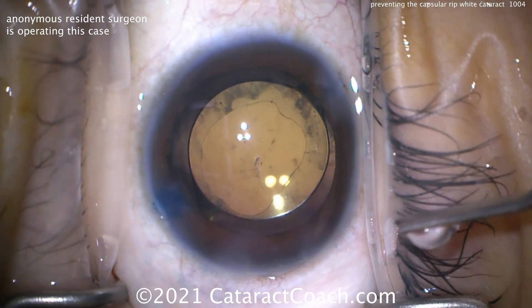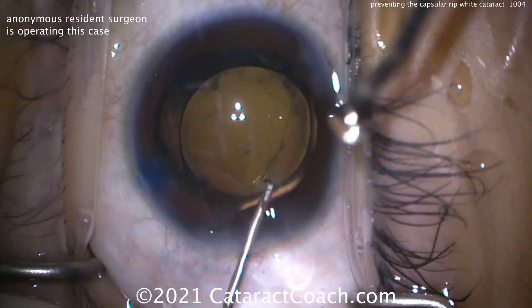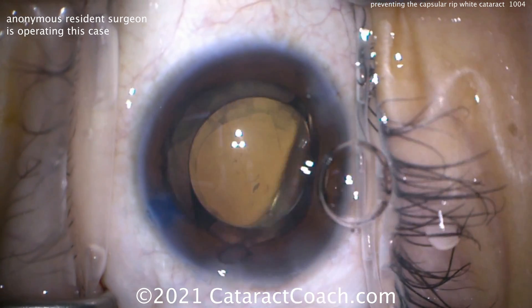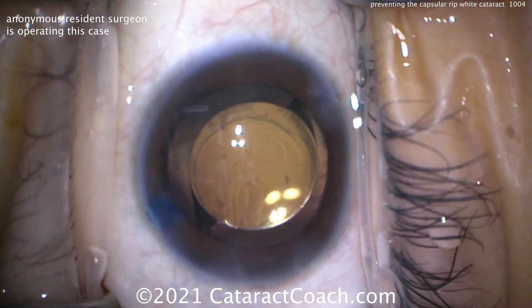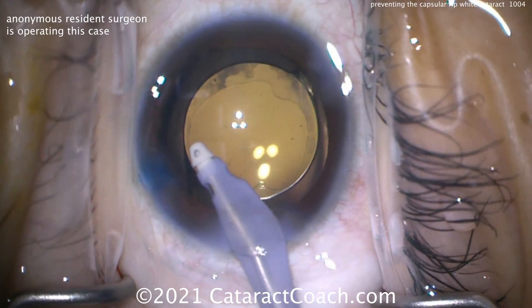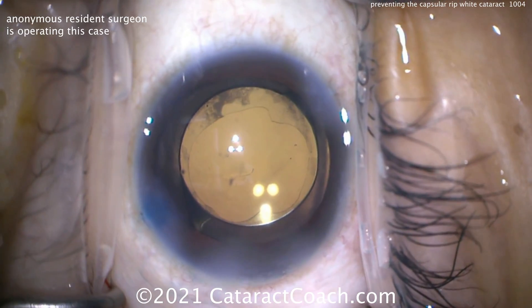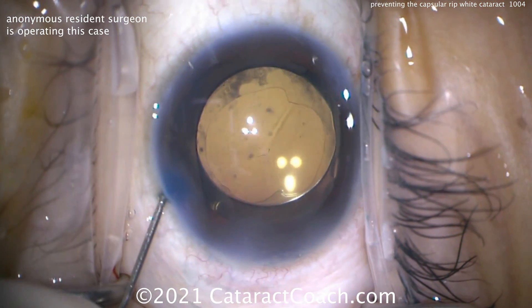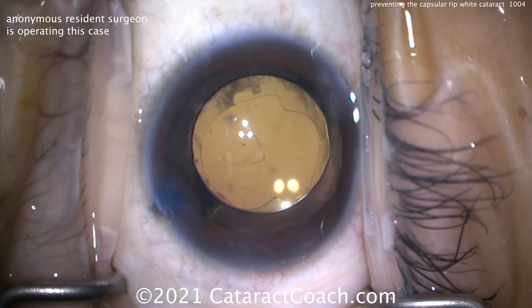So what we did differently in this case: we used the phaco probe to punch a hole in the central lens capsule and aspirate out any liquid lens cortex. But more importantly, we set the infusion pressure at 95 millimeters of mercury. That phaco probe in the eye helped prevent the high intralenticular pressure from causing issues. There were suggestions to use a larger 18-gauge needle instead of 25 or 27-gauge — it wouldn't have made a difference. The idea of using intravenous mannitol would have dried out the vitreous but would not have changed the intralenticular pressure. The best solution is what you just witnessed: go inside, puncture a hole in the lens capsule with the phaco probe — hopefully round — keep the infusion pressure up, get a baby rhexis done first, take out the cataract, and then enlarge the rhexis.